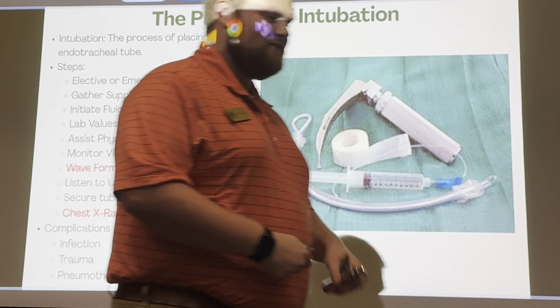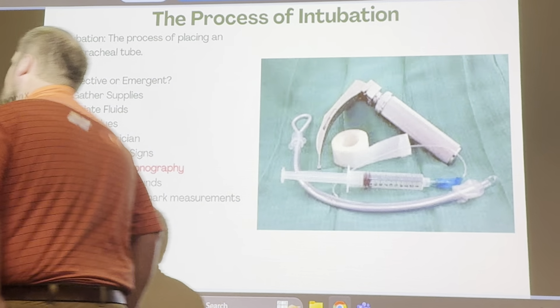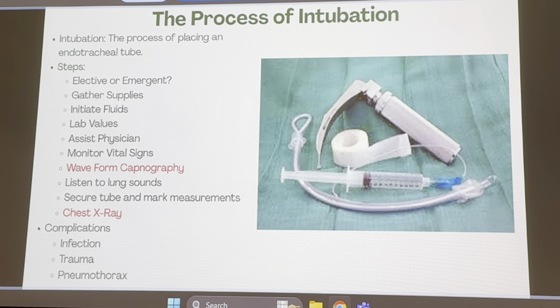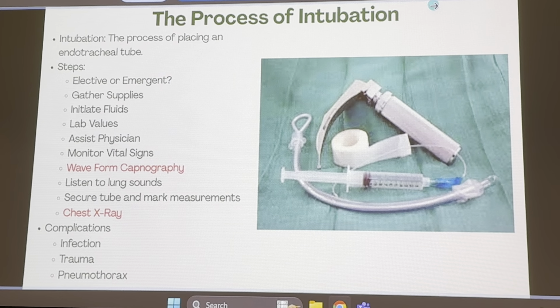Wash them hands, Dr. Floyd. And so it's very physician preference as to what size handle I need and what size blade. Tell them to be quiet. Let's close this other door. Are we that excited? Washing our hands, I don't know.